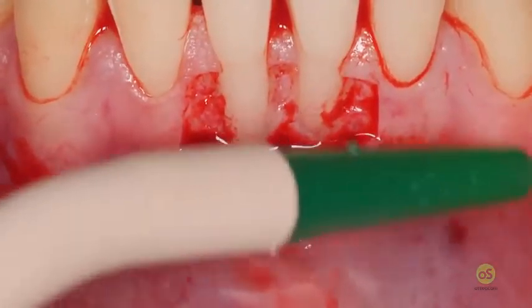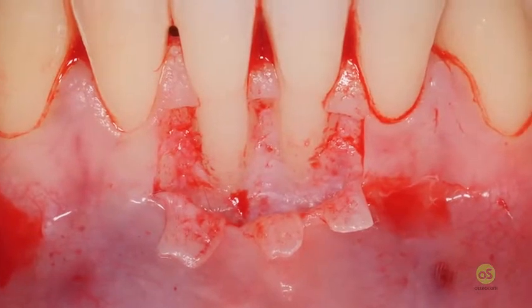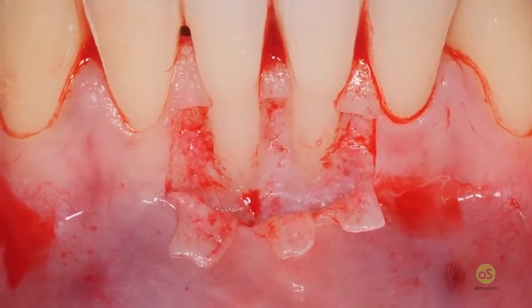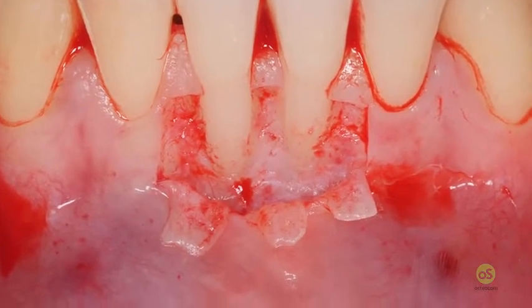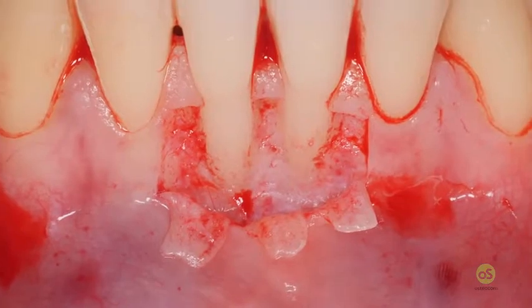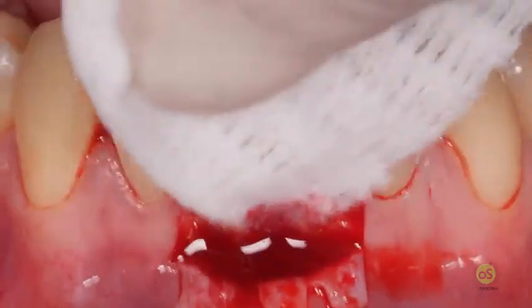So the deep incision in the lower incisors is much deeper than in the upper jaw, because it's now necessary to increase the vertical dimension of the vertical release incision in order to get my alveolar mucosa free from the lip that is completely horizontal.